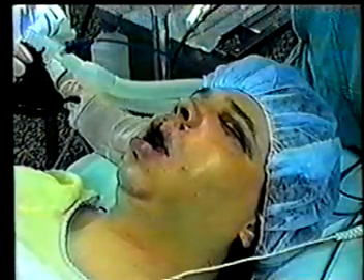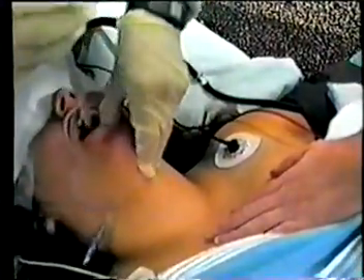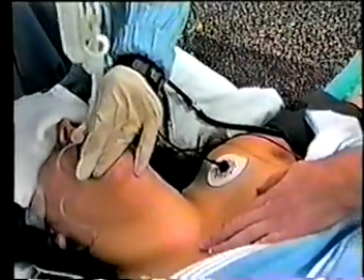The same is true for patients with restricted mouth openings or capped teeth, patients with poor dentition possibly due to trauma, or patients with a severe overbite. Light-guided intubation truly revolutionizes the placement of tubes in these patient groups.